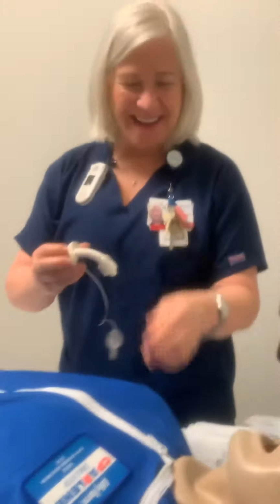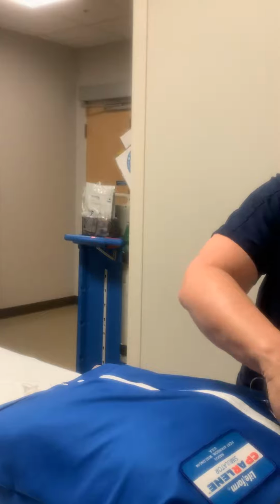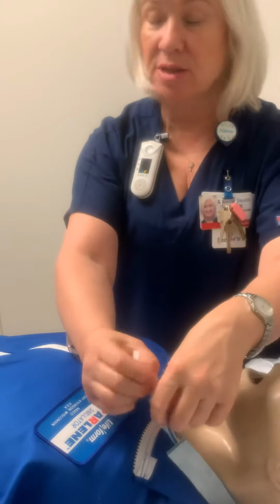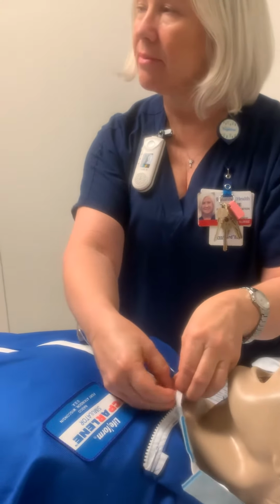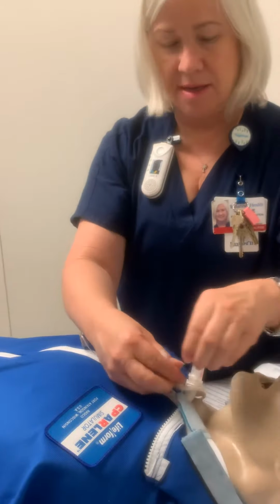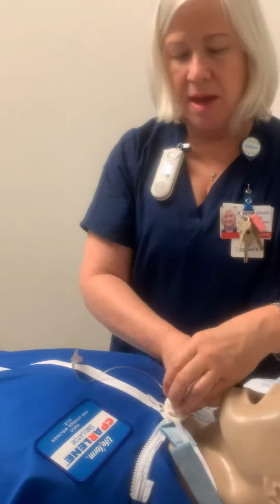Okay, so let me put this trach back in him, here. Okay. Put my ties back in. So what am I gonna do if my trach falls out? Ventilate. Where am I gonna ventilate? Cover the stoma, ventilate the mouth if you can.